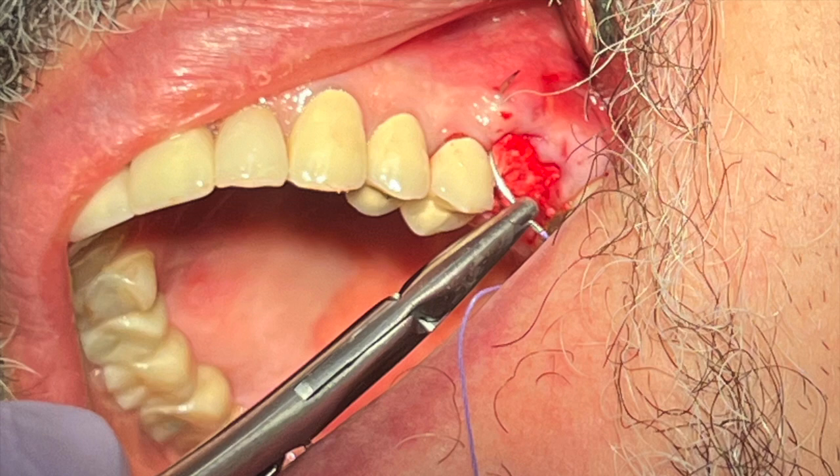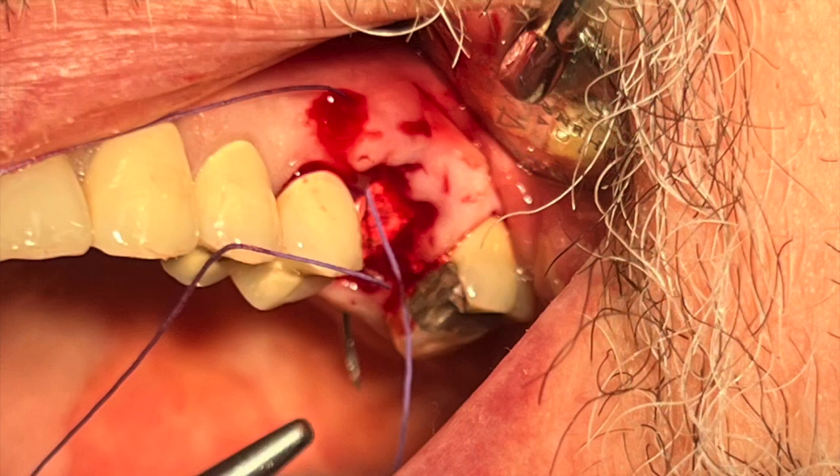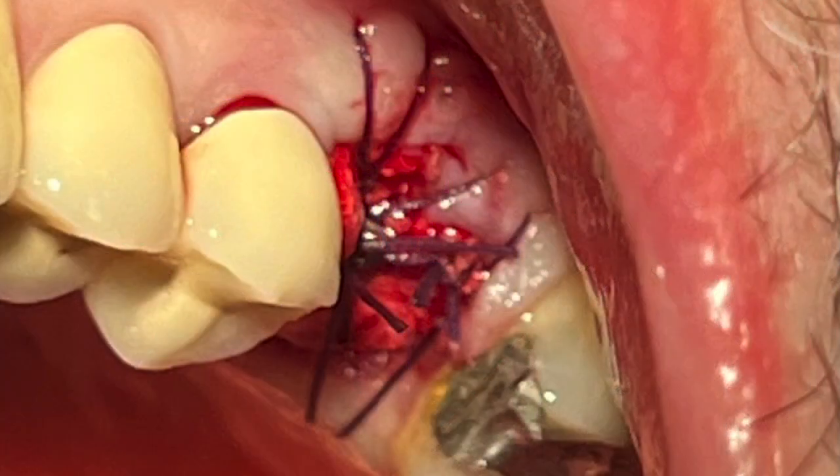I will then place some interrupted sutures, and my suturing technique is always consistent — from crest to facial, crest to palatal. I don't care about primary closure, because epithelium will grow a half a millimeter to a millimeter a day, but I want to evaluate the band of attached gingiva.